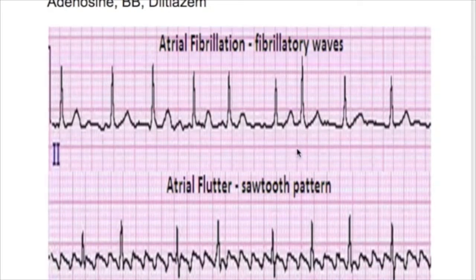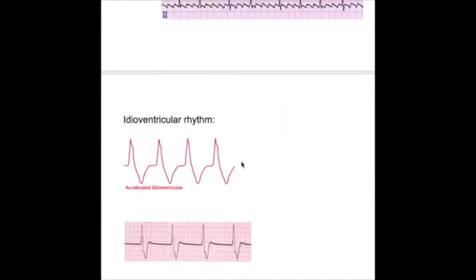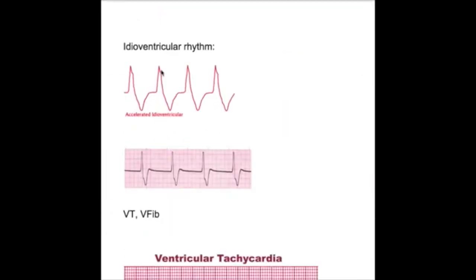Idioventricular rhythm: bizarre QRS complexes, P wave is buried but cannot be seen. What's idioventricular rhythm? When both SA node and AV node are knocked down for any reason, ventricles beat on their own.